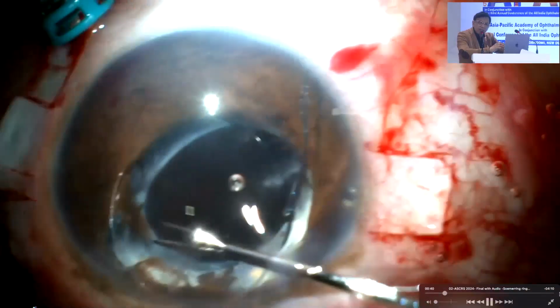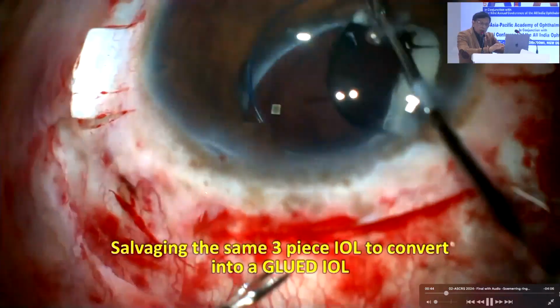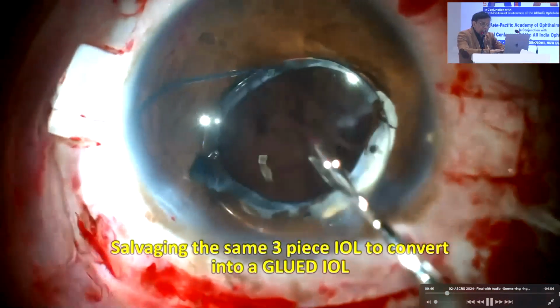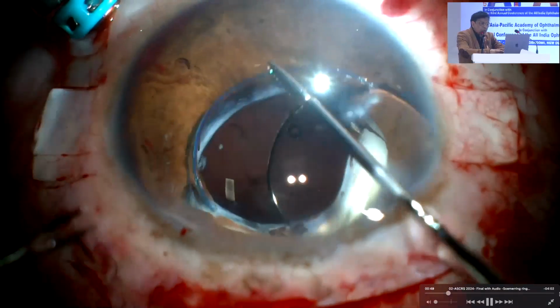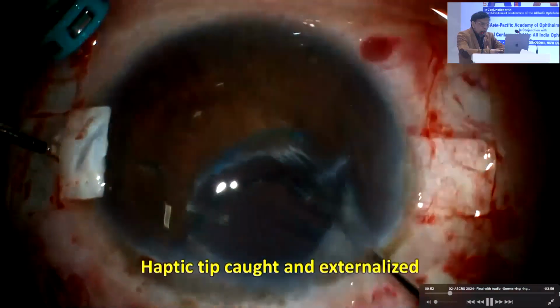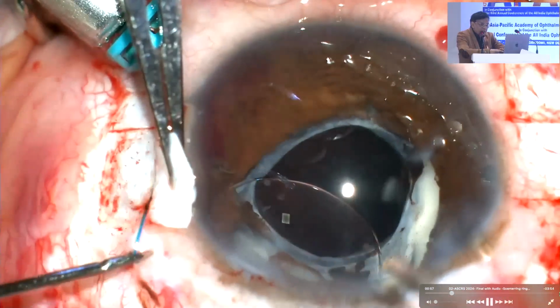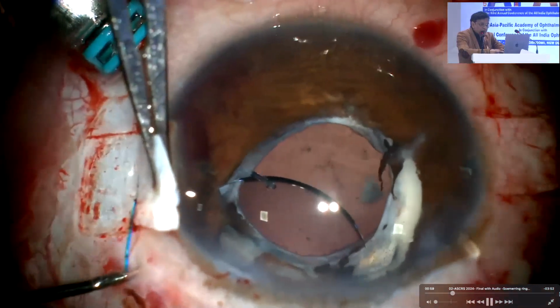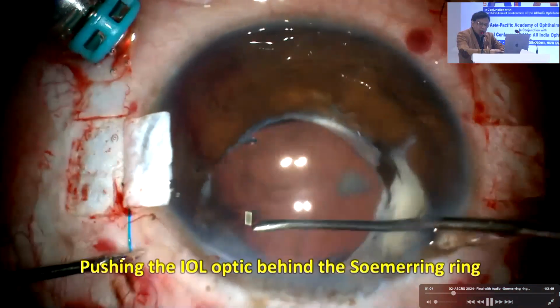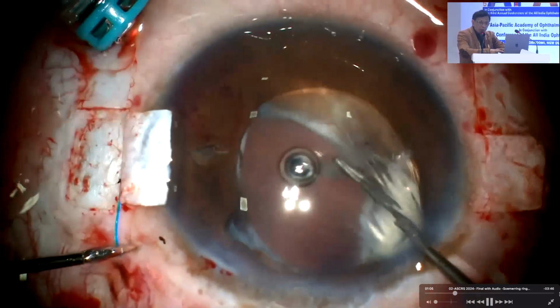Now my game plan is very simple. I need to create a scaffold. So if I create a scaffold, then I can remove the Soemmering ring, because the Soemmering ring will not fall down. So now look what I'm doing. I'm now going to do a handshake technique, and I'm bringing that IOL from above the iris to behind the iris. So you see, one haptic is out. Now I'm going to do the second haptic.